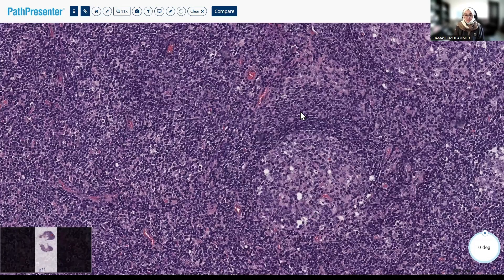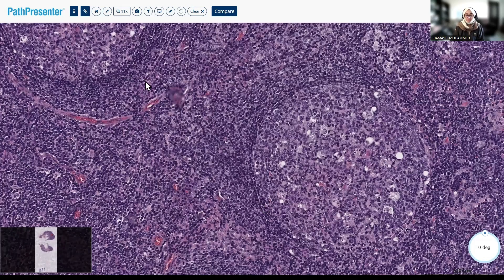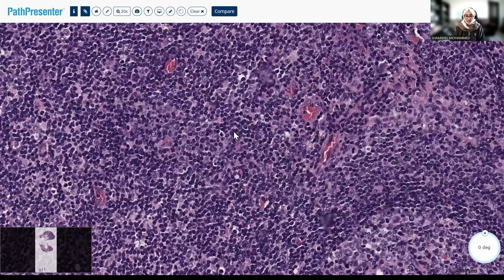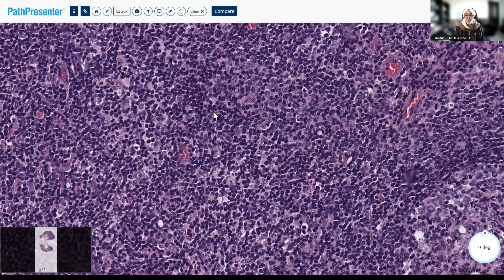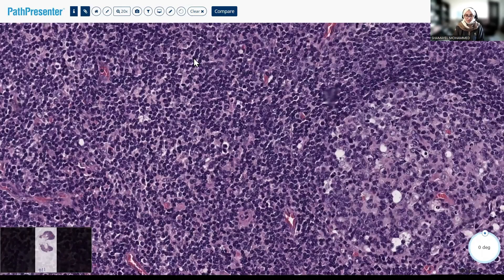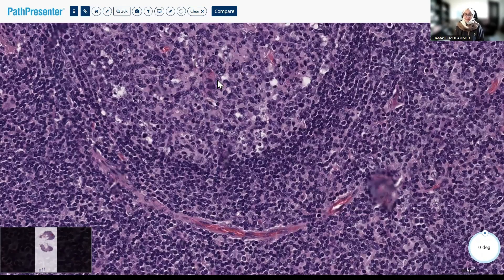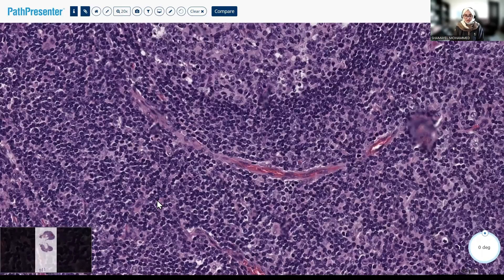Between these follicles, this area is the paracortex. The paracortex houses the T cells — they are small to medium in size with clumped chromatin. You will also see histiocytes and immunoblasts in the paracortex, and you might also see immunoblasts within the germinal centers. Reactive immunoblasts can be of B cell or T cell nature.